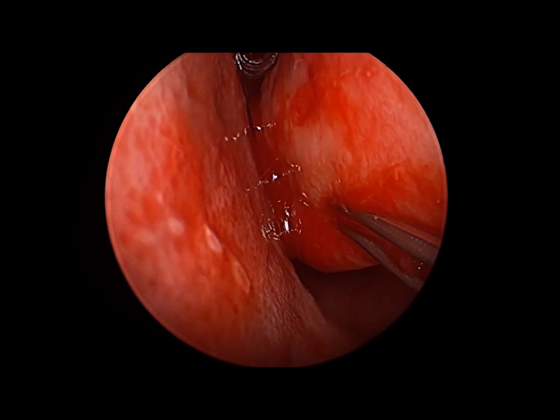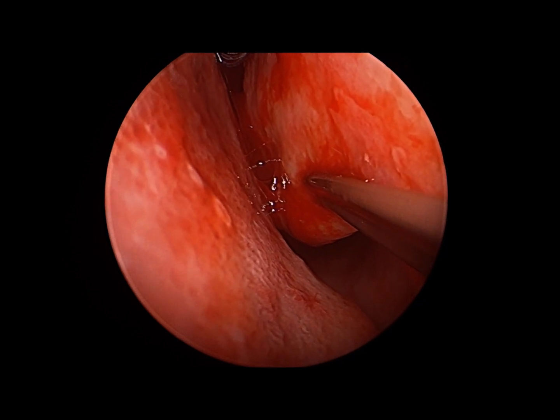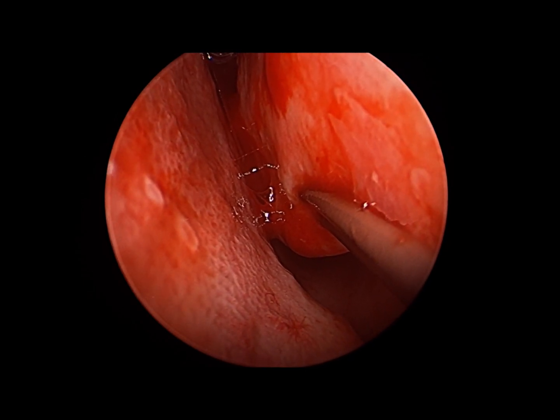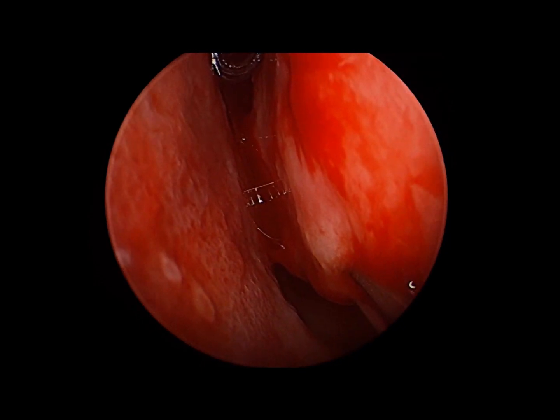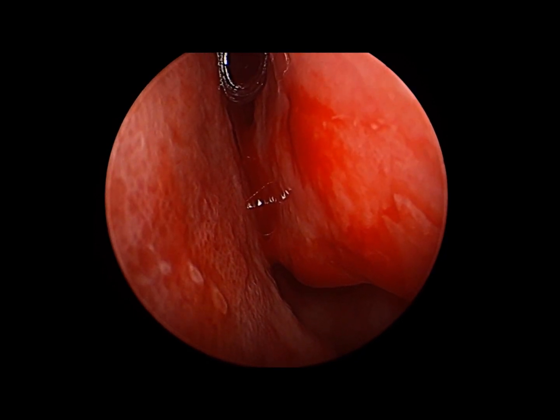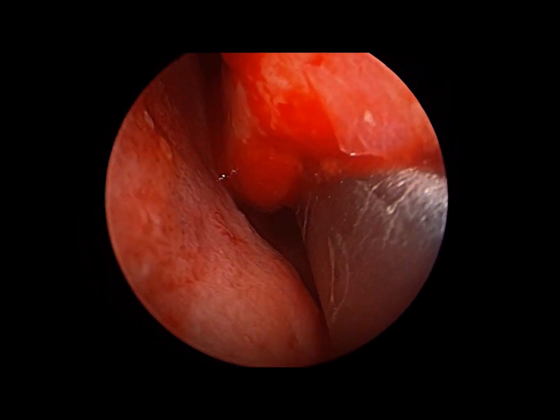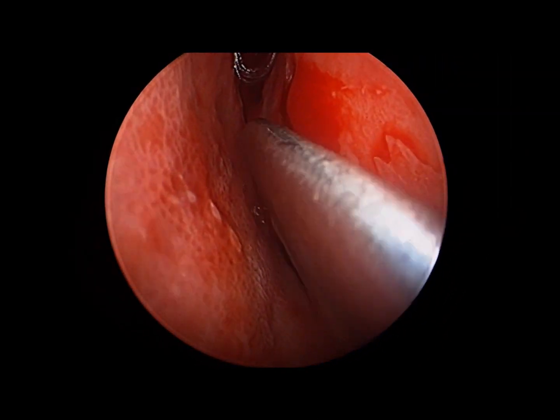This radiofrequency treatment works very well for patients that have what's termed rhinitis of recumbency — patients that will have nasal obstruction when they lay flat. This is the opposite effect of your feet getting swollen at the end of the day, because your feet are below the level of your heart. Typically during the day your nose is above the level of your heart and blood will flow out of your turbinates, but when you lay down flat blood can engorge your turbinates, and radiofrequency can help combat that.